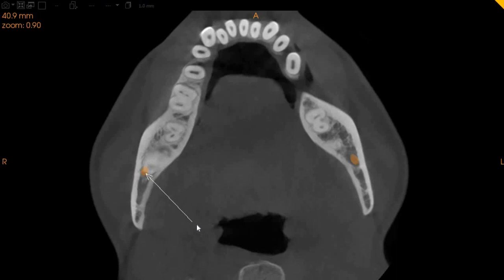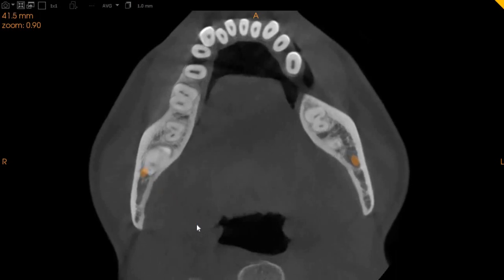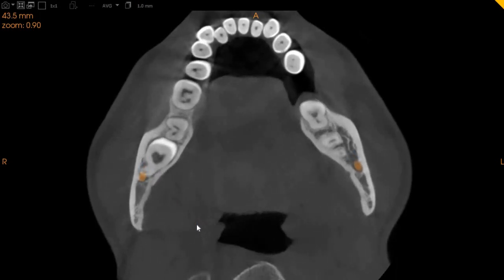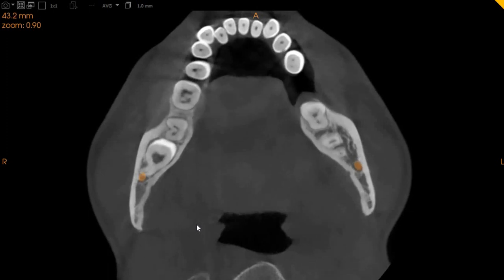This is the axial view. Here also you can see that the roots are very intimately in contact with the inferior alveolar nerve from every angle, and the nerve is being compressed by the lower right wisdom tooth.